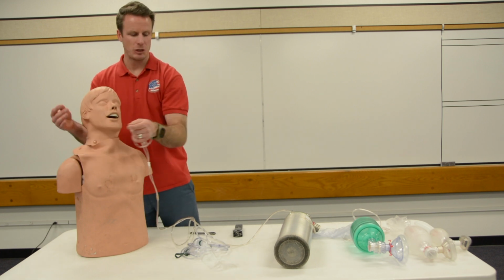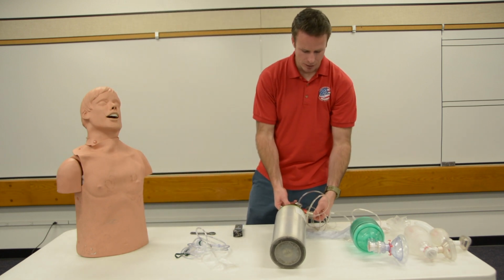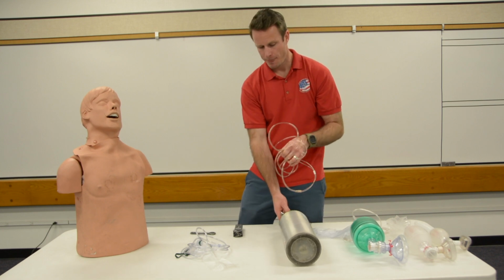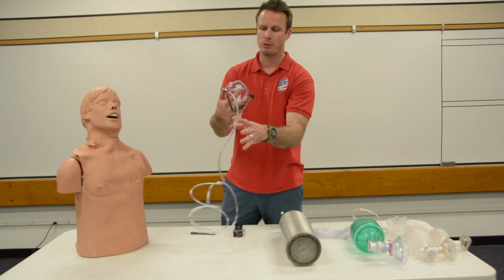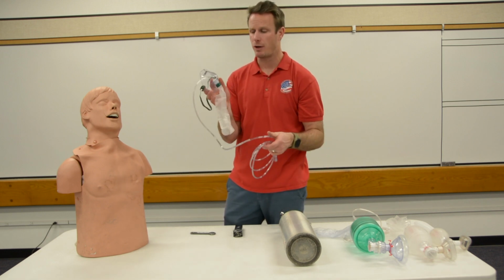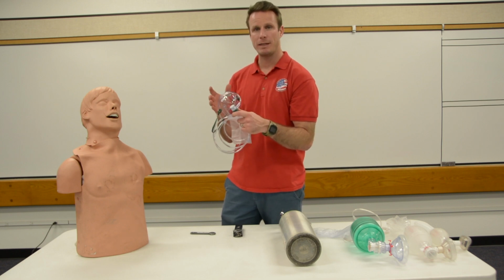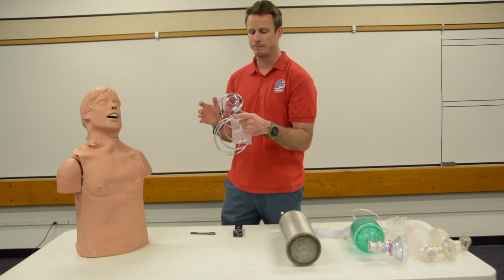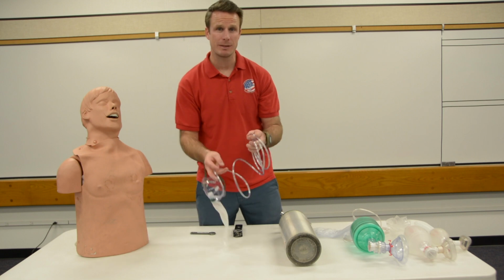Now, if I decide that my patient needs more oxygen than a nasal cannula can actually deliver, then I'm going to go with my non-rebreather mask. Now, this is my non-rebreather mask right here. My non-rebreather mask is able to give high concentrations of oxygen. This is really beneficial for any patient who's maybe in shock, or any patient who is having respiratory distress or respiratory difficulty.